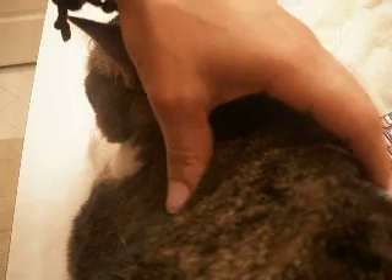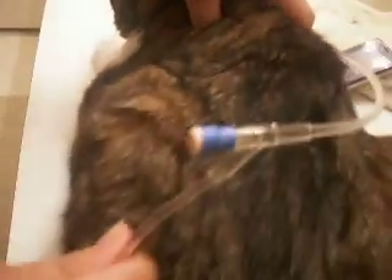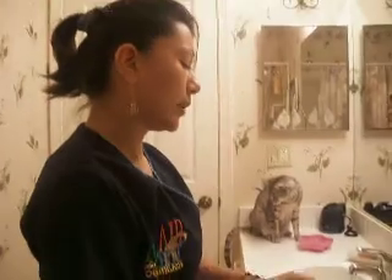The fluids are forming a little bubble of water — those are the fluids going underneath his skin. When I finish giving him his fluids, it's going to have a little bubble here under the skin, but it's going to be just a small bubble, and then it's going to be absorbed by his body and used little by little.